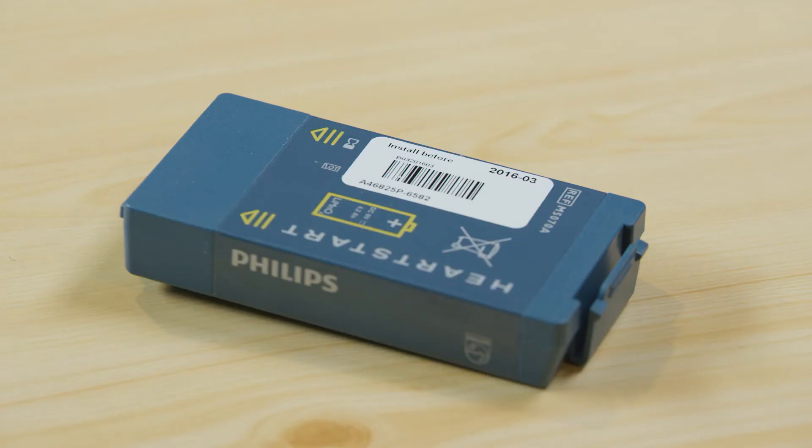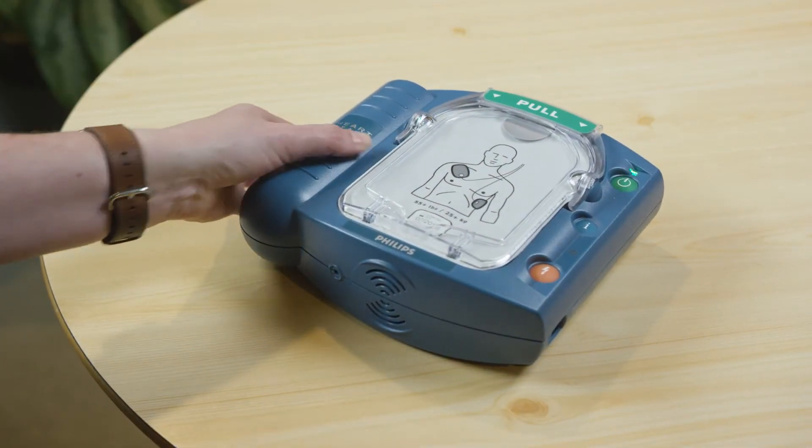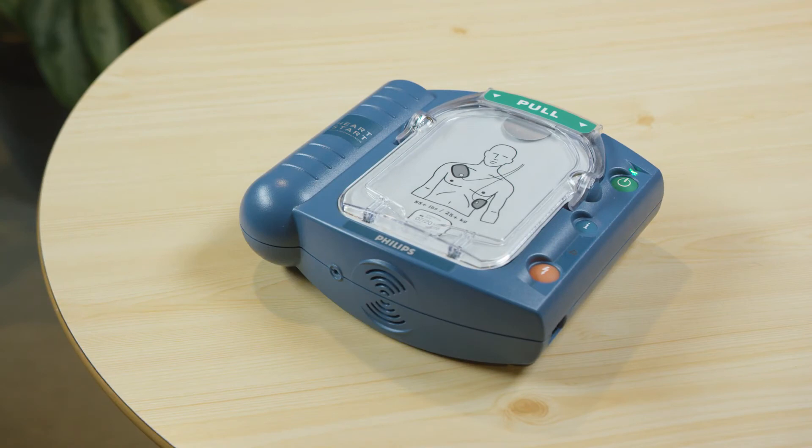The battery can be recycled at an appropriate recycling facility. As soon as the new battery is inserted, your defibrillator will automatically begin a comprehensive self-test.